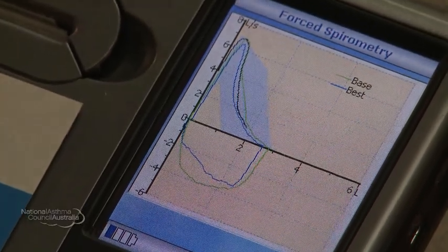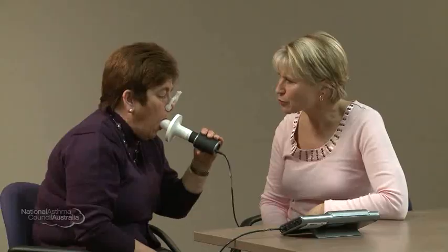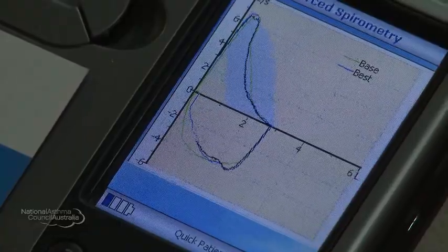So we just need to do one more. When you're ready. Big breath in and blow! Push, push, push, push — keep going, keep going, keep going. Big breath in. Well done. We've got two blows that are reproducible, so that's excellent. We can stop now.